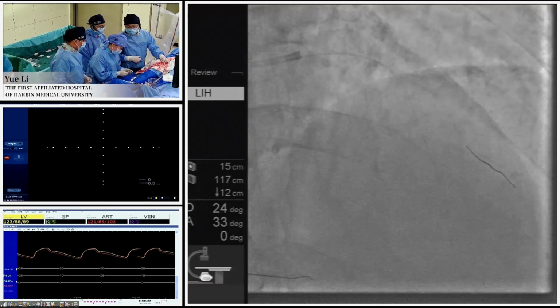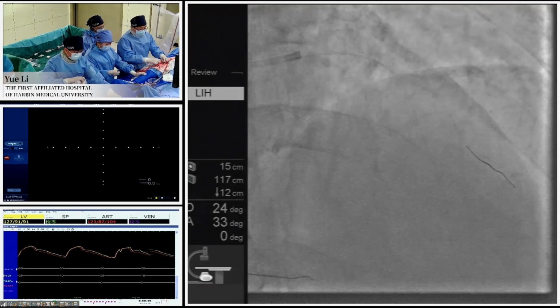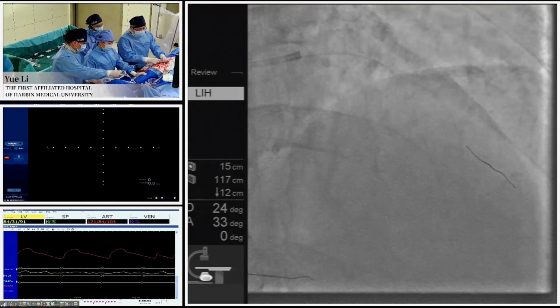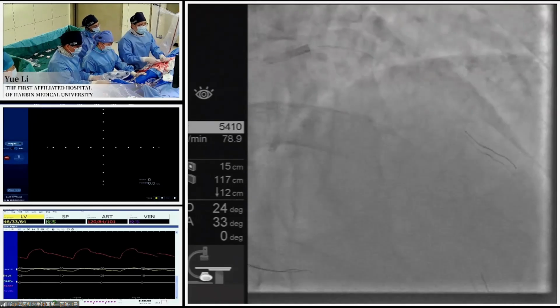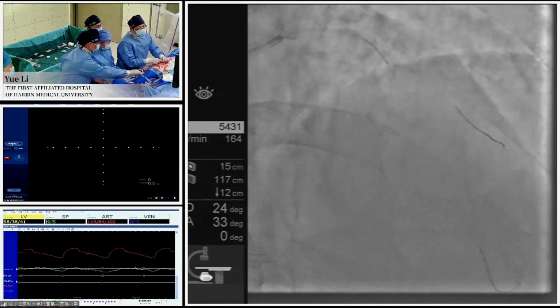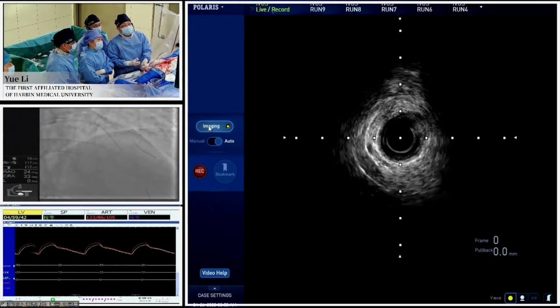So Professor Lee, is this a very important trick, to cut the tip to make the blind zone? Yeah. I dislike this technique, but I will show the audience. So we can see, after cutting the OTW segment, the crossability is reduced, right? Reduced sometimes, but a little bit better than before. Okay, we passed on the first try. I think we need to flush it. Yes, flush.